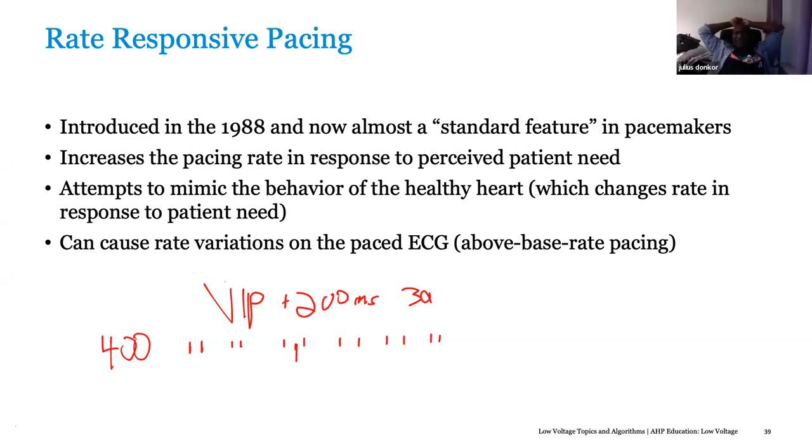Dr. Duffy, the Spheras have got AAI. Remember, we did that recently. No, they don't have it, sir. They don't have AAI mode. They don't have AAI to DDD. They don't have it separate, bro. So which one did we do recently that was AAI to DDD on a Sphera? That's an Azure. That is our Azure, sir. But we've not done a Sphera that has got that, no? No, no, no, sir. Sphera only has this.